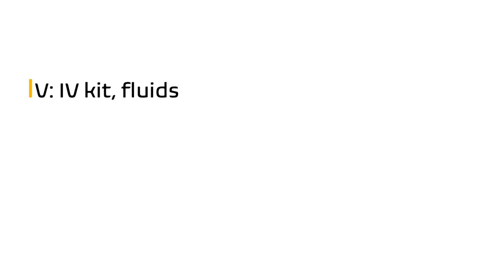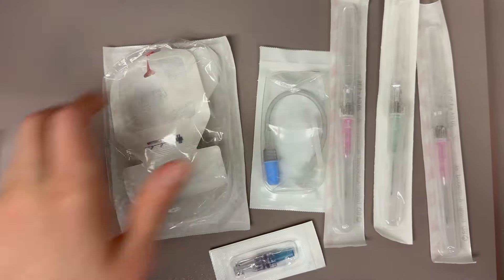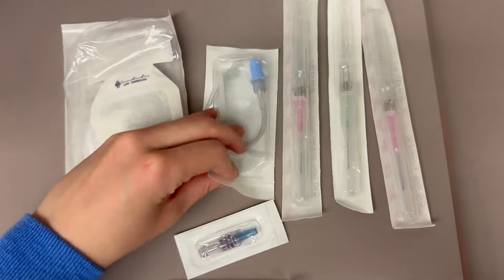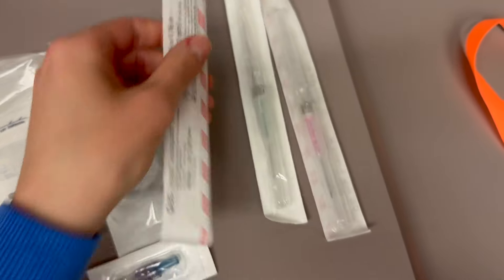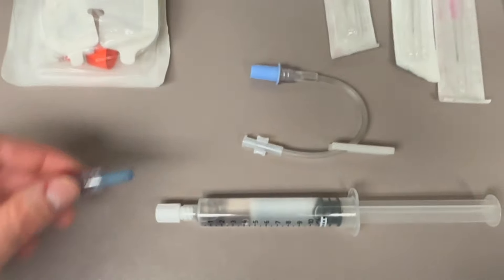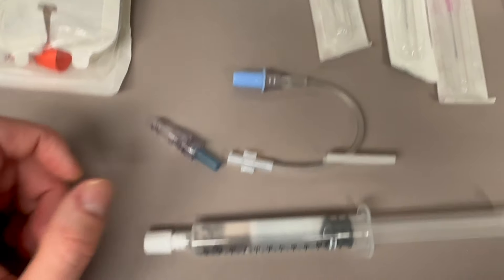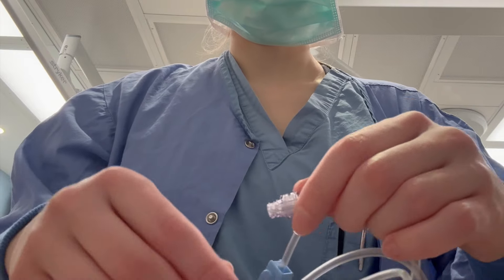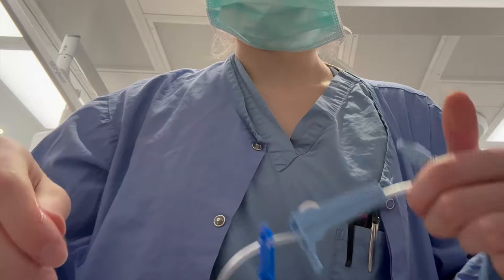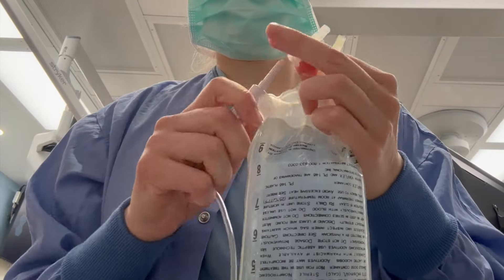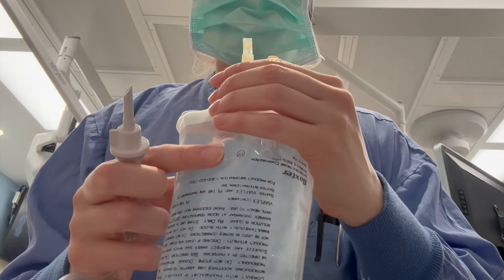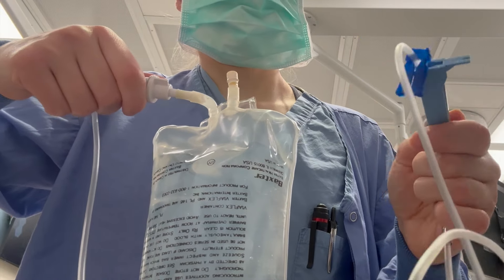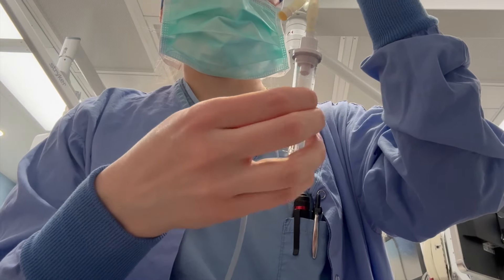Next I will prepare an IV kit in order to start a second IV as well as my lactated ringers. I have assembled my IV kit as well as a six-inch connector, a clear connector, an 18-gauge and two 20-gauge needles, and a flush syringe. The clear connector will attach to the six-inch connector with the other end attaching to my flush syringe. I will then put caps on the IV line ports to make sure they will stay clean, taking care not to touch any of the clean surfaces with my fingertips. I then attach the line to my bag of lactated ringers, making sure I burp the bag to rid of any excess air. I make sure that my line is off before pumping some fluid into the chamber to minimize air bubbles, then flush the line.